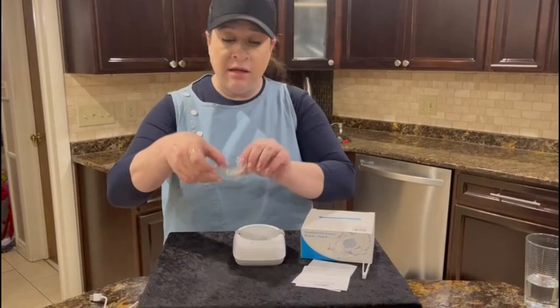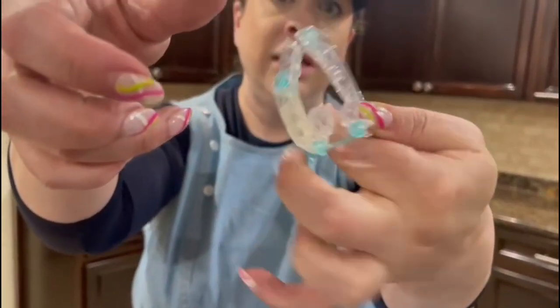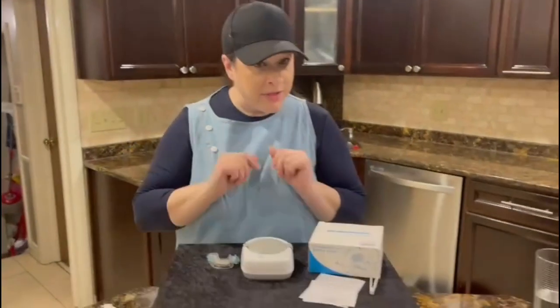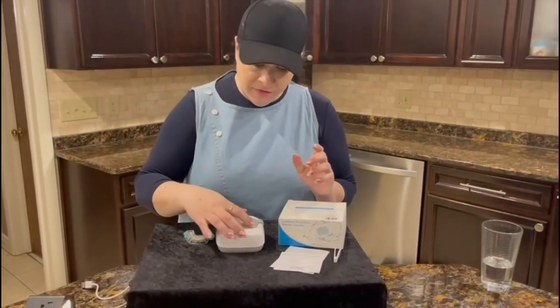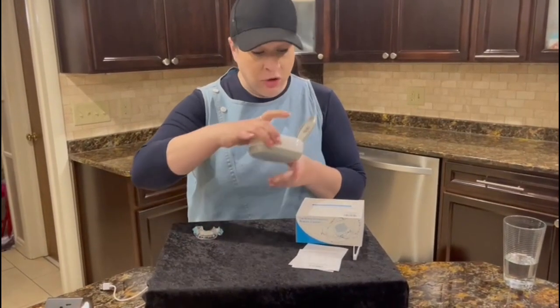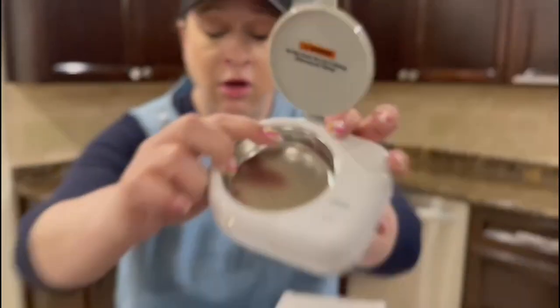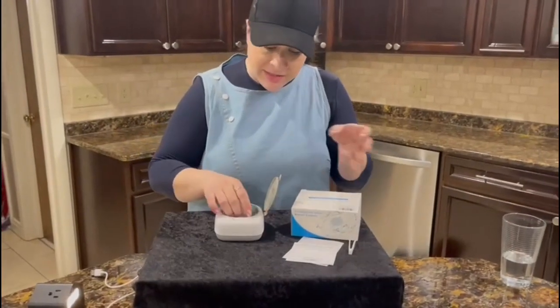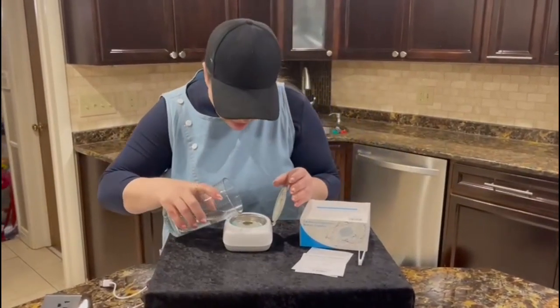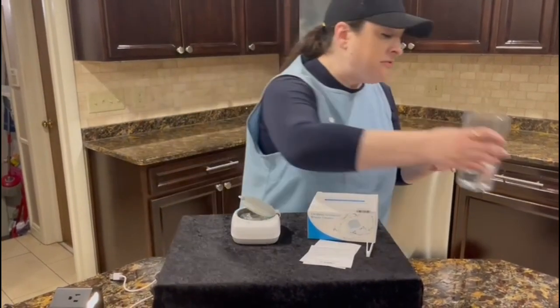This is the embarrassingly dirty mouth guard I'm going to be cleaning. As you can see, there is quite a bit of gunk in there, and we're going to see if we can get it clean. The first step is to place the retainer inside of the unit. You want to fill up to the max line, which is right there — that's how high you're going to fill the water. So I have my water right here and I'm going to fill it right up to the max line. Now it is filled.